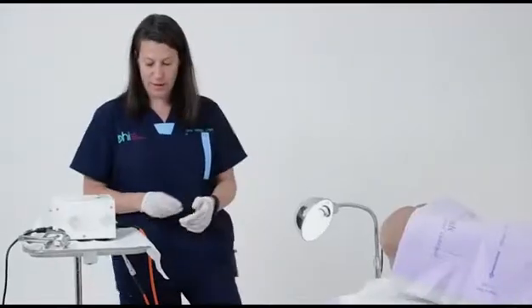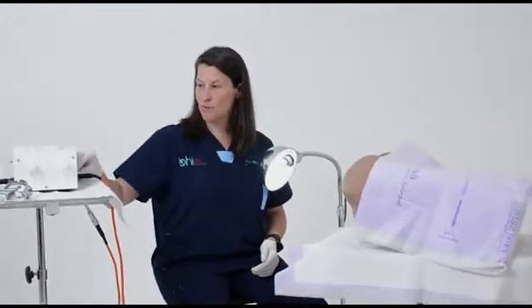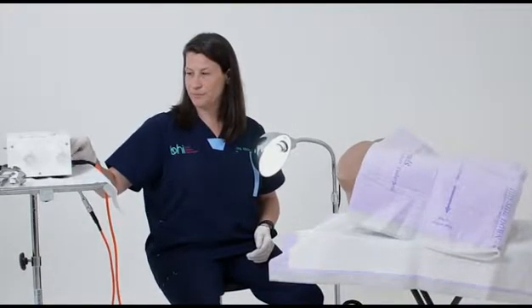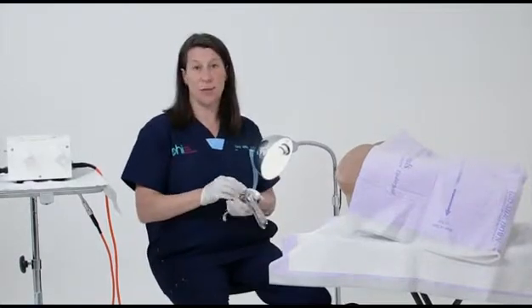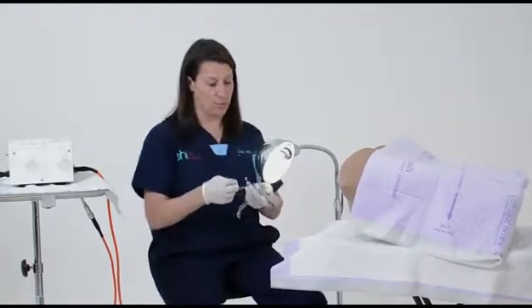Now the most important thing to remember with this treatment is that you want to be very careful, because the probe gets very hot. So you need to be very careful to protect the vaginal walls, because you don't want to burn anybody with the probe.